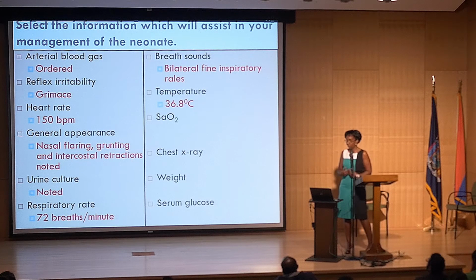What is our role in that as respiratory therapists? Our role is making sure that any equipment that we use for that baby is set properly, so that we're not adding to the cold stress. Our role is also, when that baby's on the radiant warmer, looking to see whether or not the temperature probe is on the baby and in the right location. Even though it's maybe something that you may not put on, if you work in the NICU, you can make that part of what you do. You should make sure that the temperature sensor is definitely on the baby.